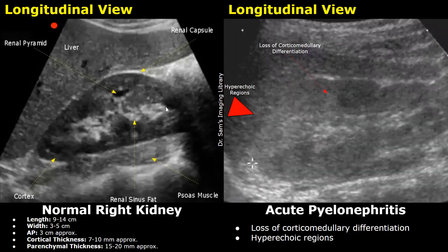In this image we can see hyperechoic areas in the upper pole of the right kidney. This was also a case of acute pyelonephritis, and there is loss of corticomedullary differentiation as well.